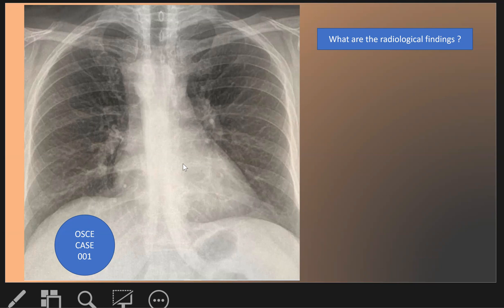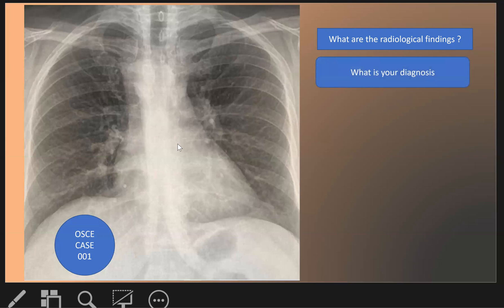So this is a classic case of right-sided aortic arch.